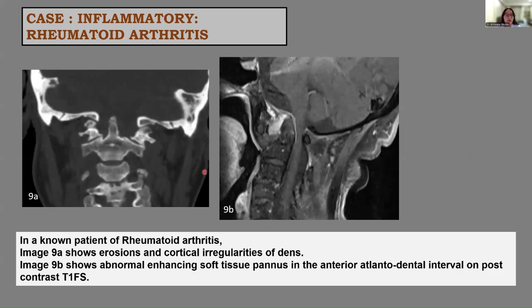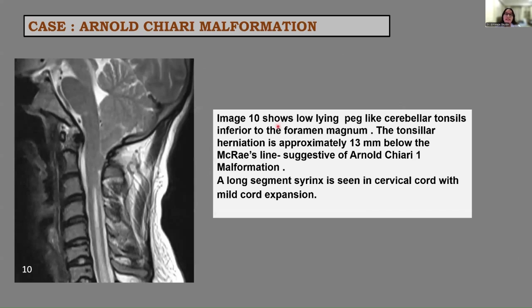Next is a 55-year-old female, a known case of rheumatoid arthritis with neck pain. Image 9A shows erosions and cortical irregularities of the dens. Image 9B shows abnormal enhancing soft tissue pannus in the anterior atlanto-dental interval on post-contrast fat-saturated images. In such cases, MRI is needed to evaluate soft tissue abnormalities. This was also a case of Arnold Chiari malformation with low-lying peg-like cerebellar tonsils inferior to the foramen magnum; tonsillar herniation was 13 mm below McRae's line, suggestive of Arnold Chiari type 1 malformation, with a long-segment syrinx in the cervical cord and mild cord expansion.